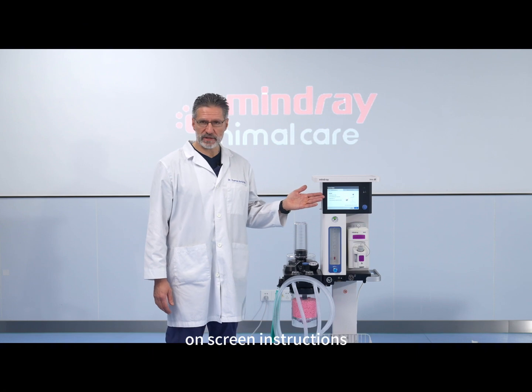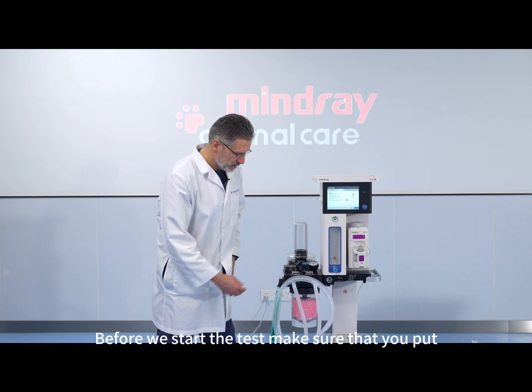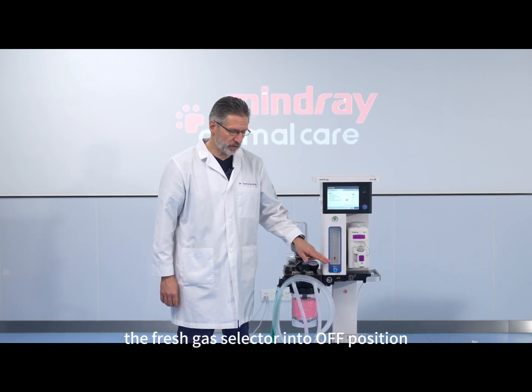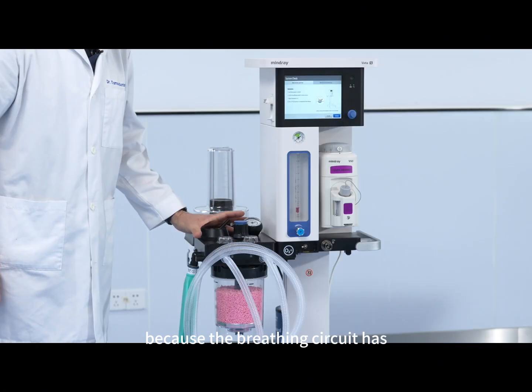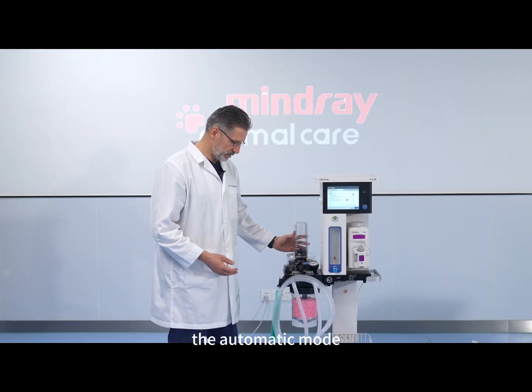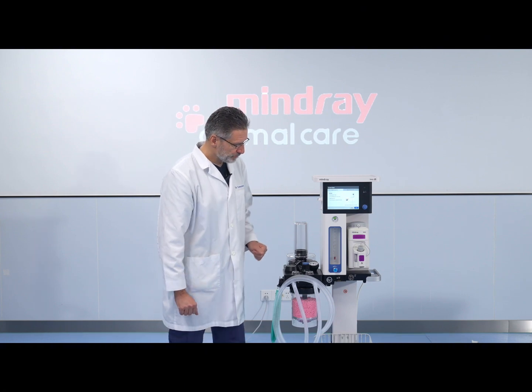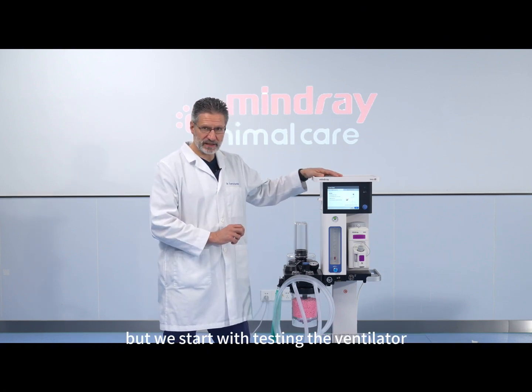You just have to follow the on-screen instructions. Before we start the test, make sure that you put the ACGO — the fresh gas selector — into the OFF position, so that the fresh gas is directed towards the breathing circuit. Because the breathing circuit has two modes of operation — the ventilator (automatic mode) and the manual mode with the bags — we will test both automatically, but we start with testing the ventilator.